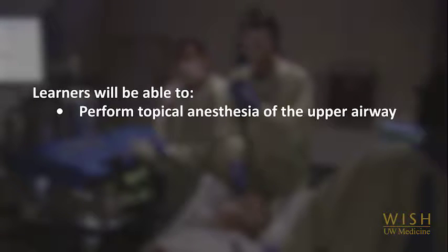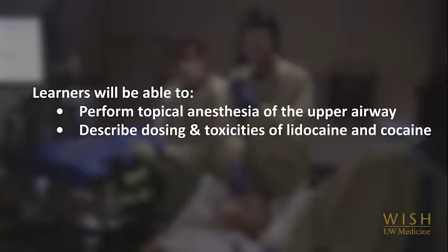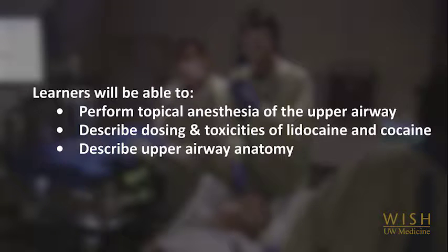In this module, we will demonstrate how to prepare a patient for flexible bronchoscopy by anesthetizing the airway, discuss the relative merits of the various methods of airway anesthesia, and describe the mechanisms of action and the risks of airway anesthesia. We will also demonstrate normal upper airway anatomy as it is encountered during flexible bronchoscopy.